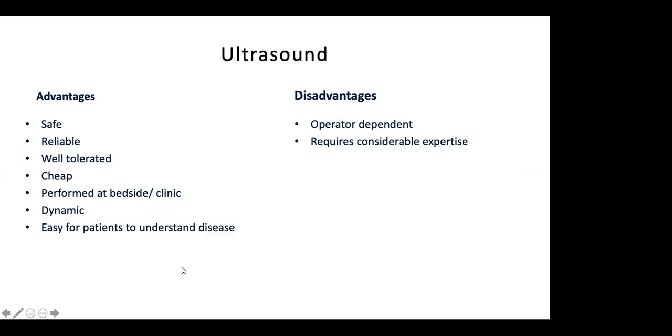A little bit about ultrasound. This talk is mainly looking at the basics of rheumatology ultrasound. We won't cover everything, but it's just to give you a little bit of a flavor, and we can do a Q&A at the end where I'll be available for any questions. So why ultrasound?